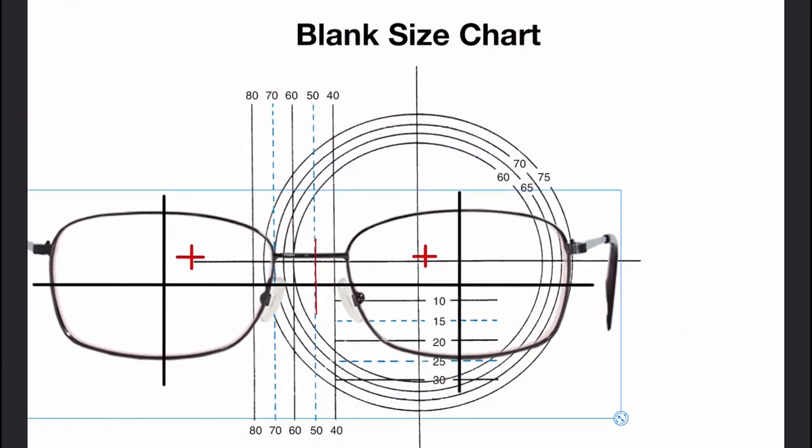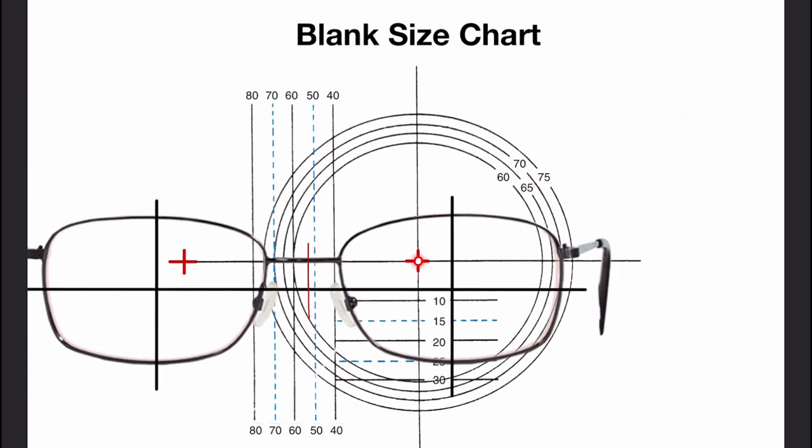Now, the frame is aligned with the fitting point on the chart. Before the diameter is selected, you want to make sure that the center of the bridge is aligned with the patient's PD, and the bottom of the frame is aligned at the fitting height. If the patient's fitting point wasn't marked on the lens, we would use these lines to align the fitting point in the same way.